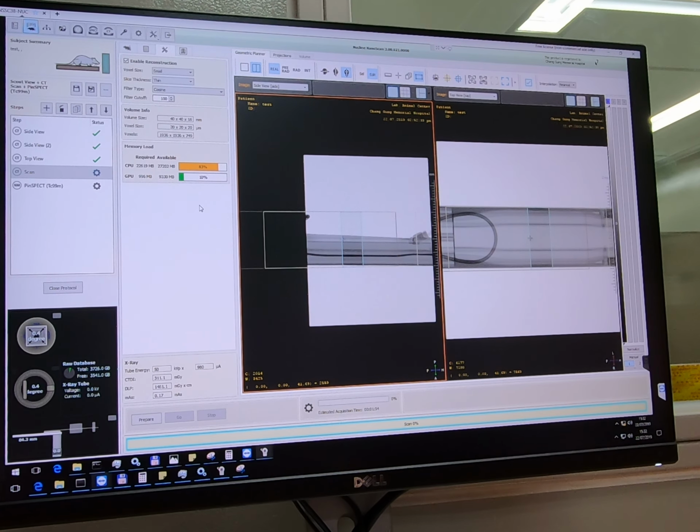Or what I've said, that you have to reconstruct one part, and then in a new reconstruction process reconstruct some other part next to the first one and so on, and then stitch them together. But it's really exceptional, when you have a complete study with this kind of resolution and this kind of volume size or field of view size.